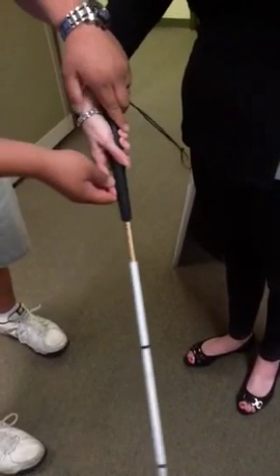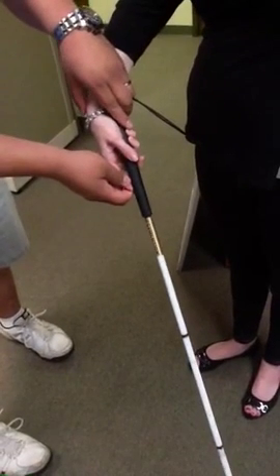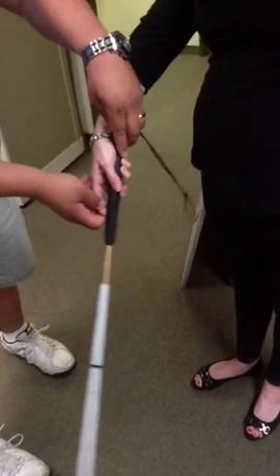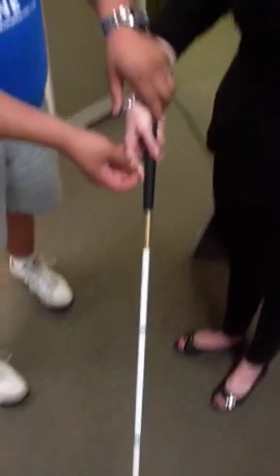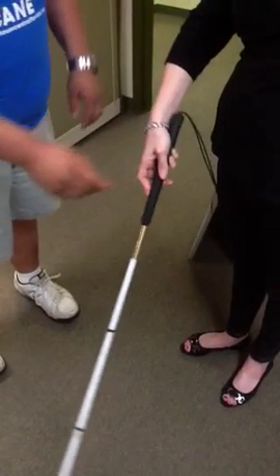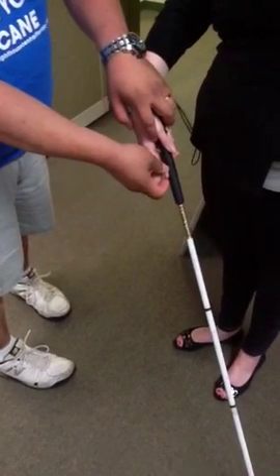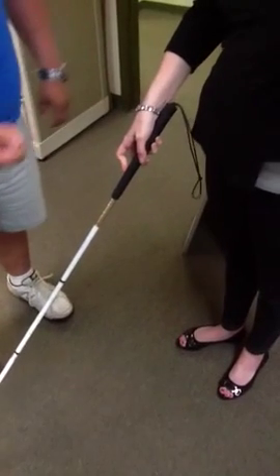Okay. So this is called the fingertip style of holding it. I know for some reason I got that wrong, but this is one way of holding it. So you're going to use your fingertip. Push your fingertip straight, or pull your finger straight. Straighten it out, it'll bend it. Pull it back, it'll bring it back. It takes a lot of wrist movement on that.